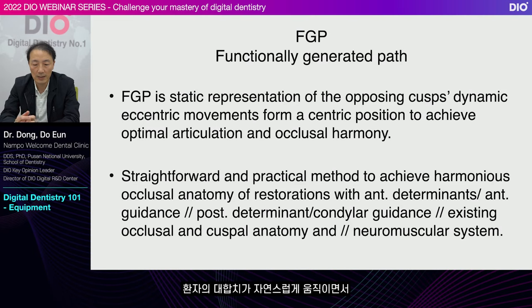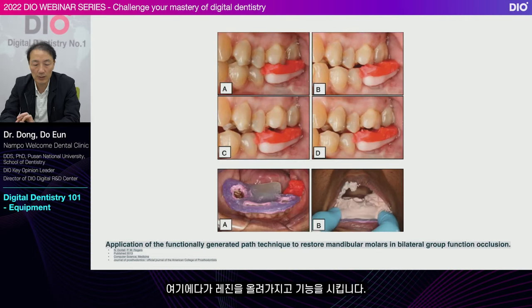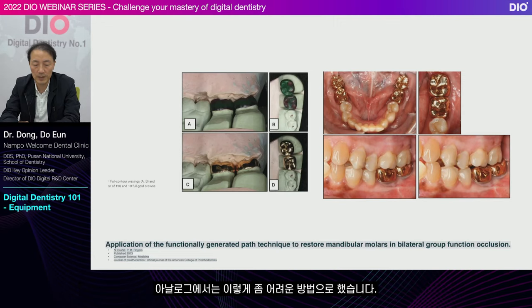As the patient's opposing teeth move naturally, they form occlusal points on the opposite side. It's a method of transferring as is. For this method, I took an excerpt from a published journal. Add the resin. It's number 36 and number 37. Place the resin here and apply the function. If you apply the function, it'll shape the resin. Then, take the pattern and transfer it to the articulator. Then the tooth shape will transfer as it is. This is called functionally generated path. So you can see that the analog method is a bit more complex.